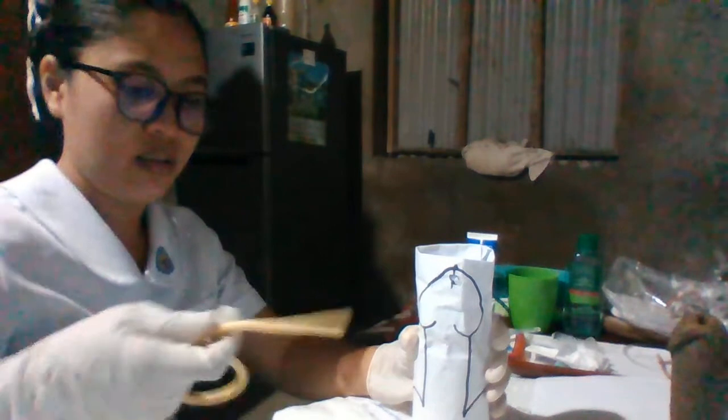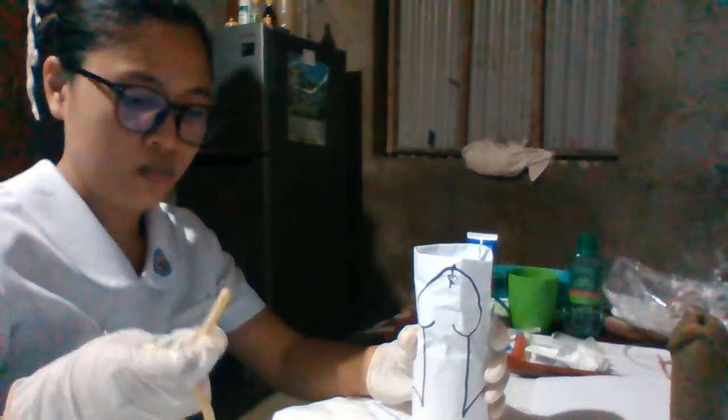7.5 to 10 centimeter, which is 3 to 4 inches from the catheter tip. In this way, we can grab it with a forceps if we need to. It depends on us or according to the procedure or the physician.